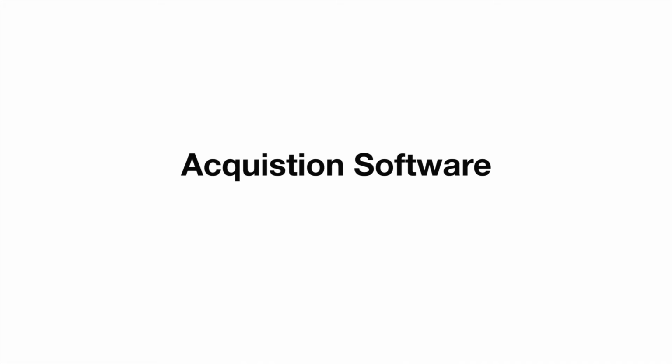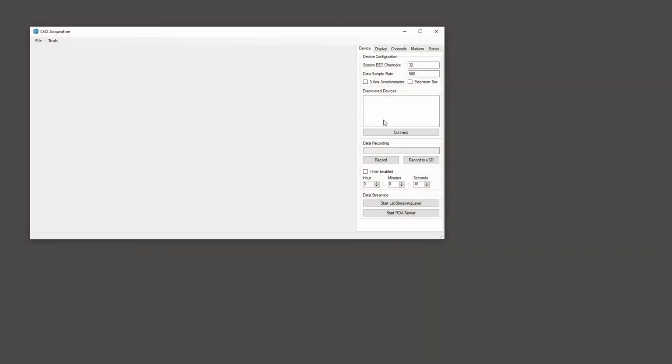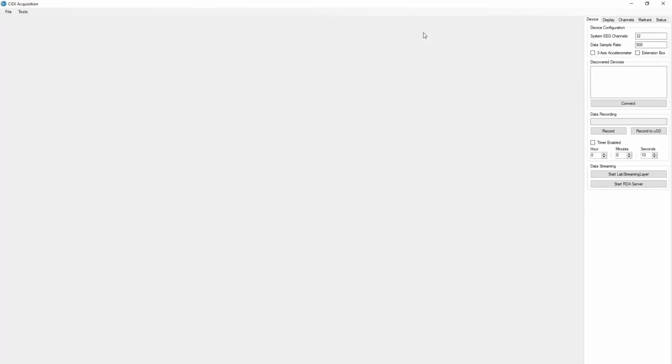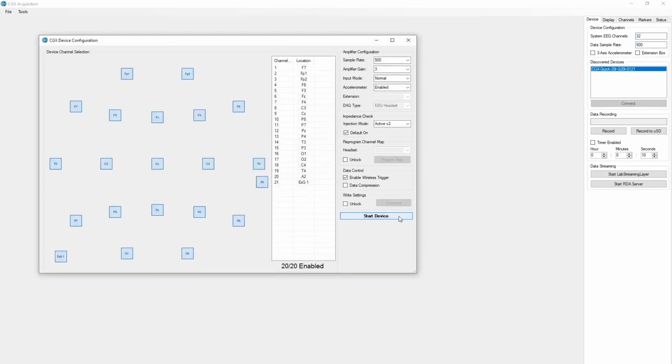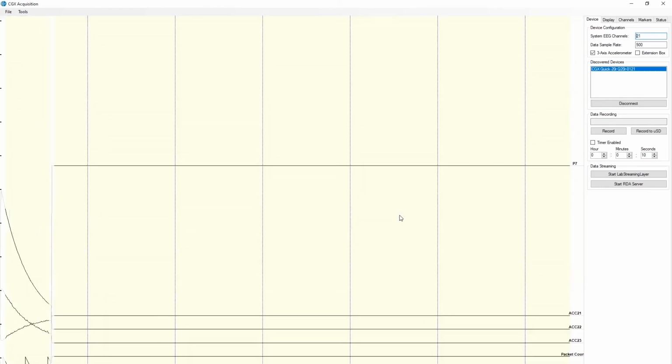Acquisition software. Once you've established a connection, data should begin to stream. Double-click on the CGX acquisition software icon. You should see your device name under Discovered Devices. Click the device name and click Connect. You should now see the device configuration window. Click Start Device. We now see data streaming into the display.